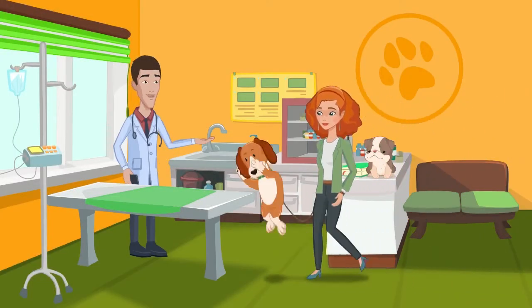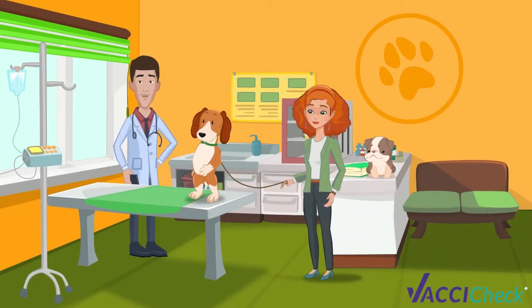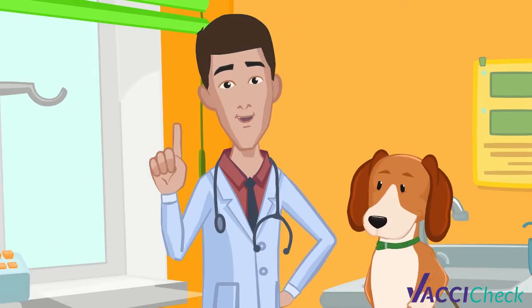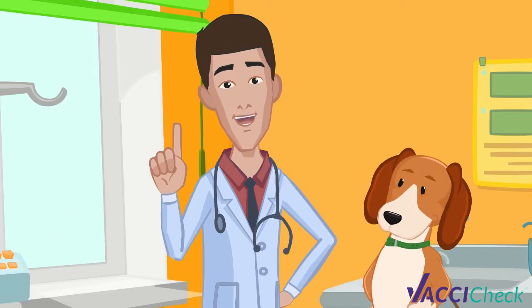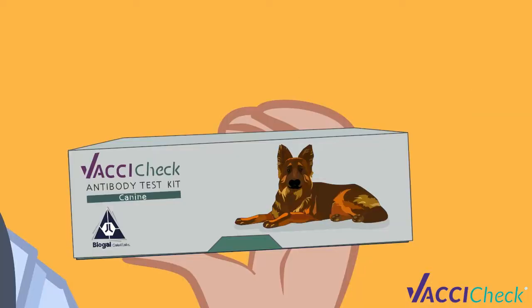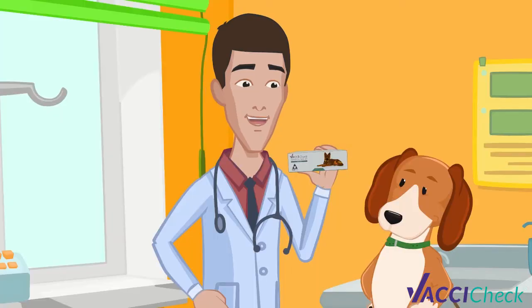As in every year, Amy takes Max to his vet for his annual wellness test. Now even before we vaccinate Max, I first want to validate if he is already immunized from previous vaccinations. VaxiCheck is a titer test that does just that. Let me show you how it works.